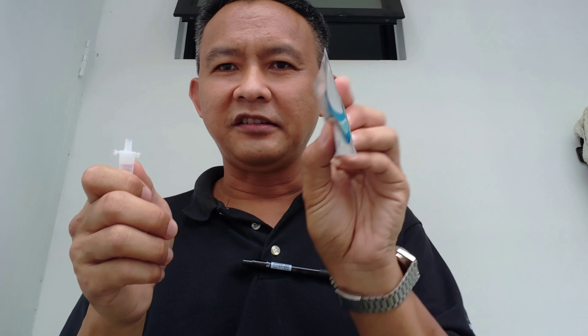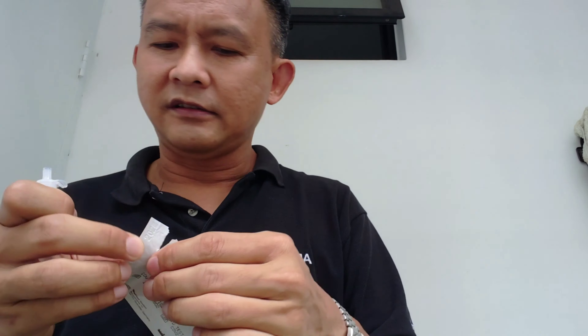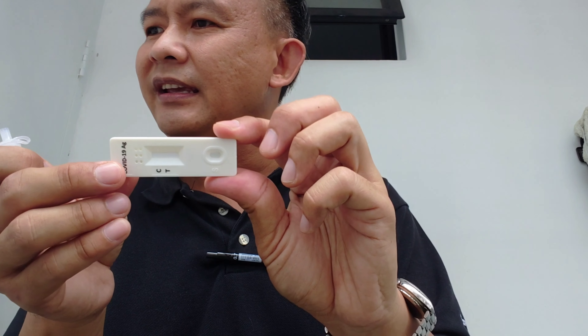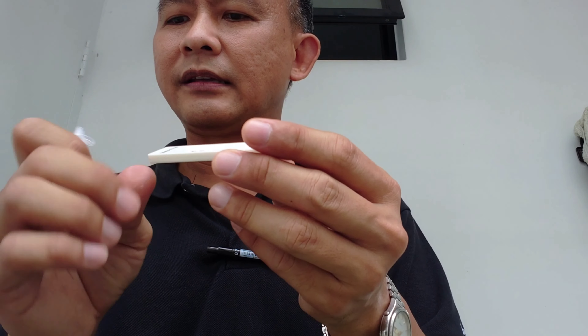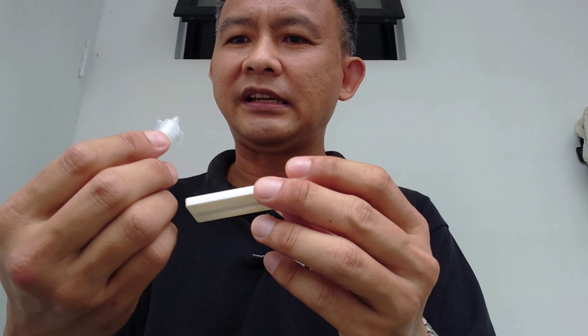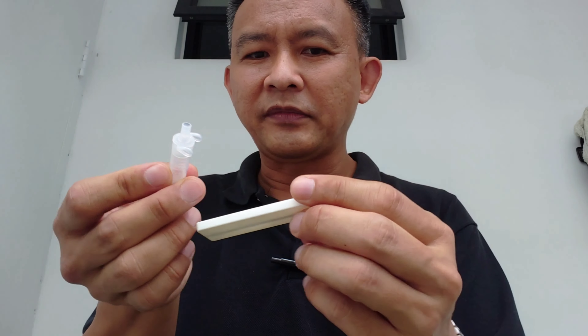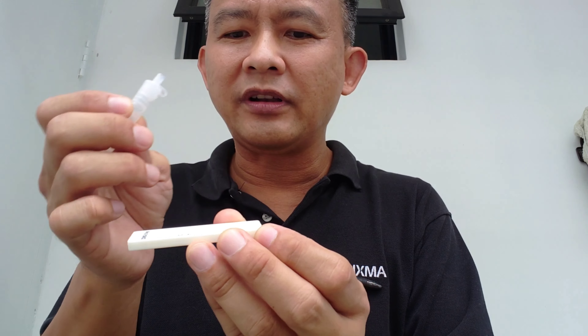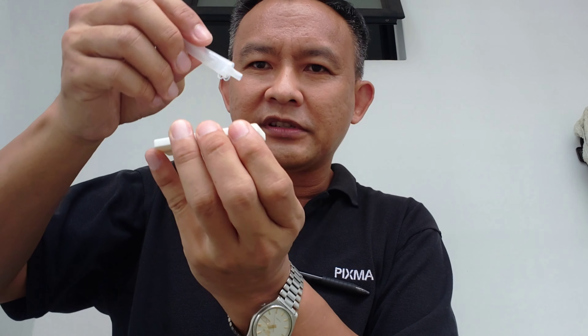Now it's time to place it on the tester. So how does the tester look like? It's like so. You turn this container upside down because it has a small hole inside, and place two drops into this part over here — the small opening — two drops of extracted specimen.